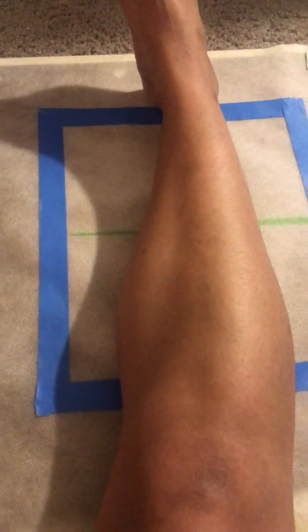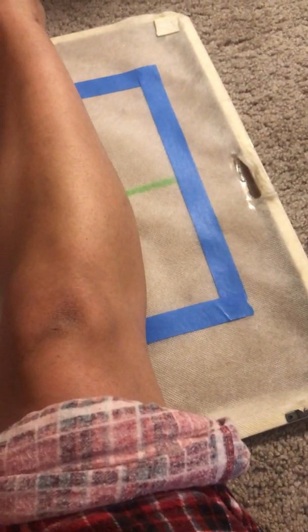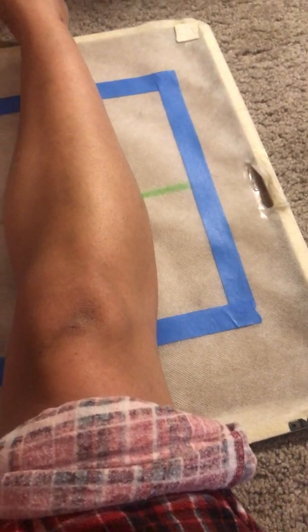We're going to be using a 14 by 17 cassette diagonally. And the central ray is directly perpendicular to the shaft through the center of the field. The AP projection of the tibia and fibula include both knee and the ankle joints if possible. So, obviously, right now this is a 10 by 12, so imagine it would be 14 by 17, sorry. Next, we're going to be doing the lateral.